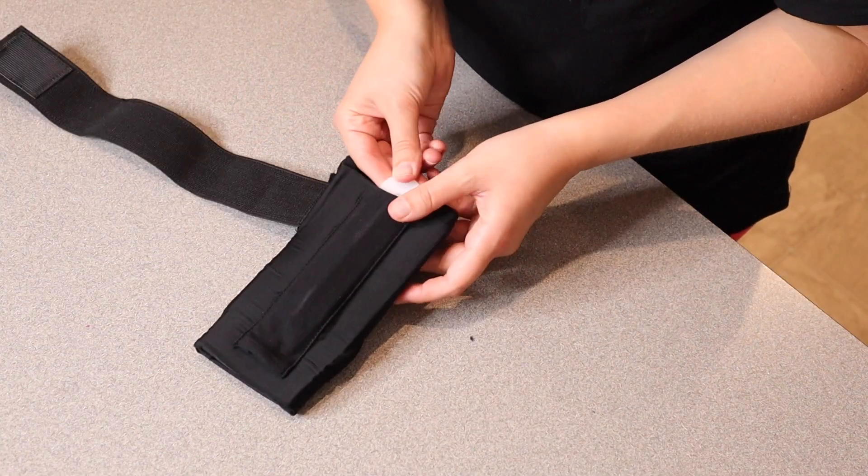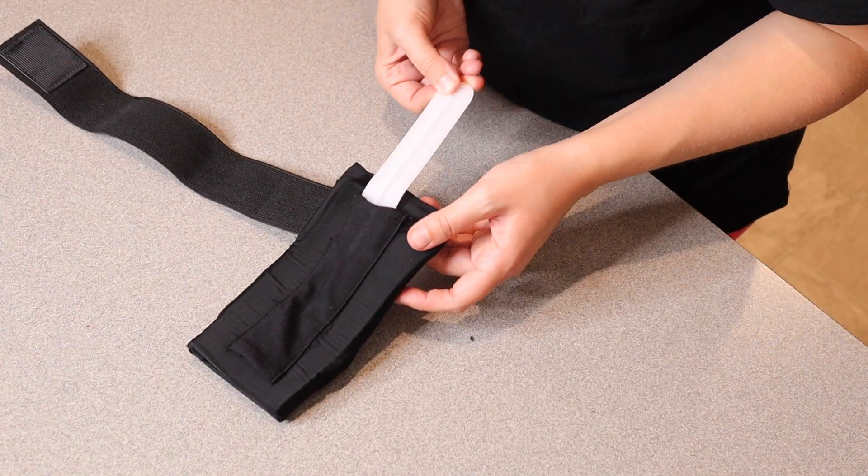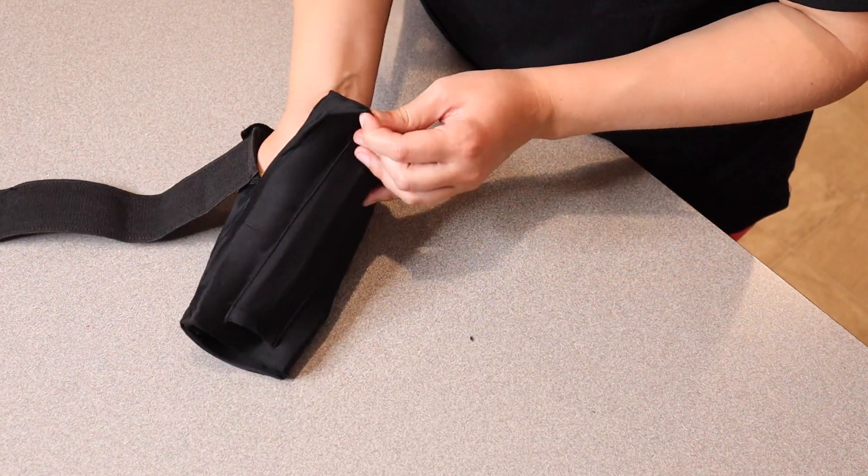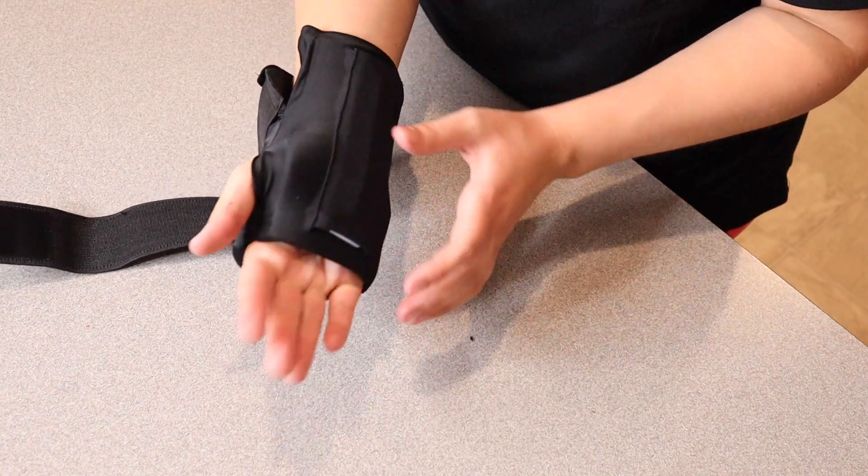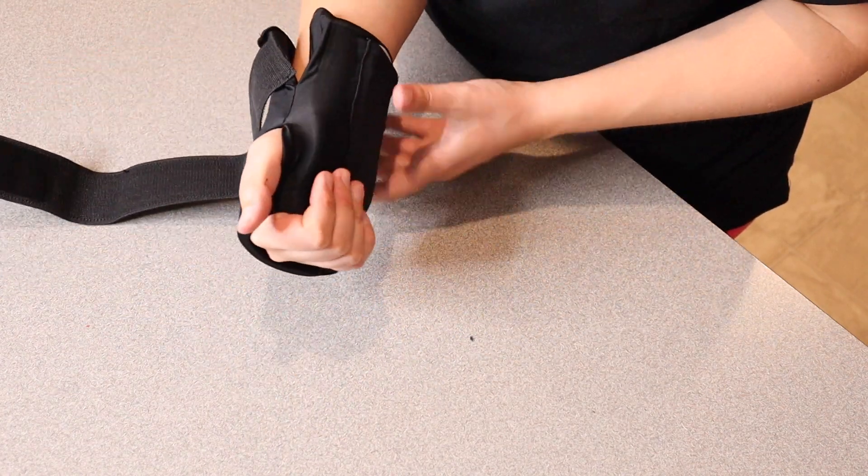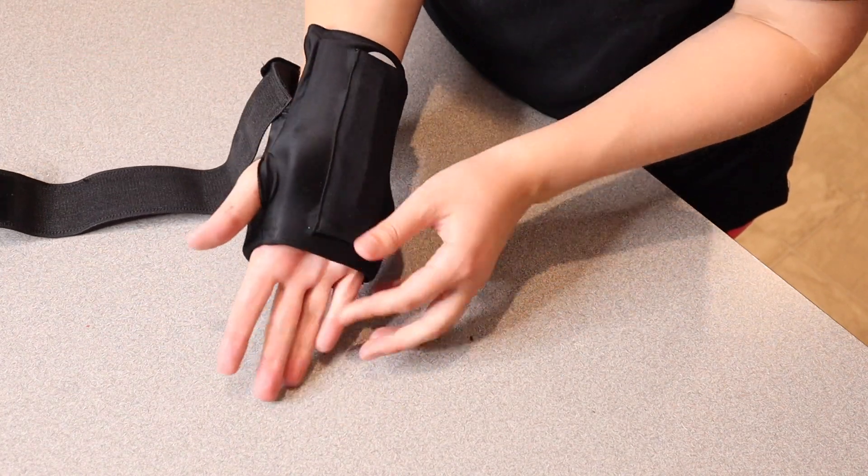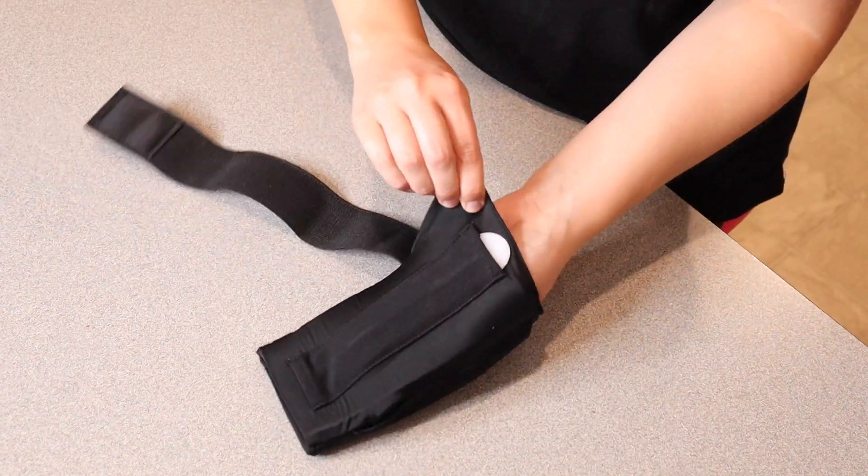So you can see with this splint in here I'm gonna go ahead and show you how you can use this for both your left and your right hand. You're gonna stick your hand in here and you're gonna have your thumb sticking out in this area and you have the splint just to create that extra stability and you can do the same thing with your left hand.